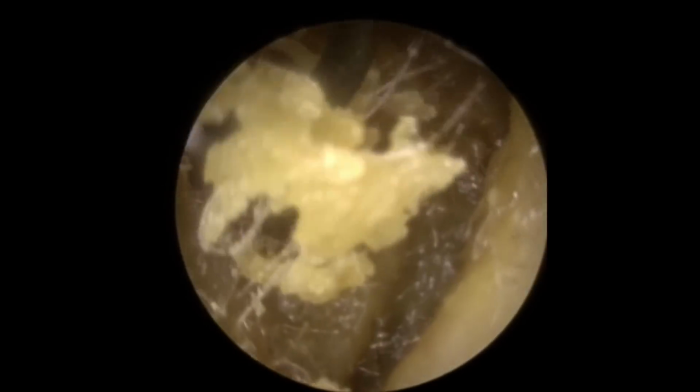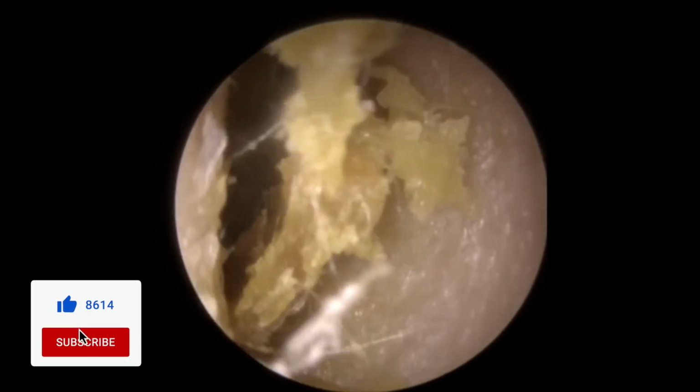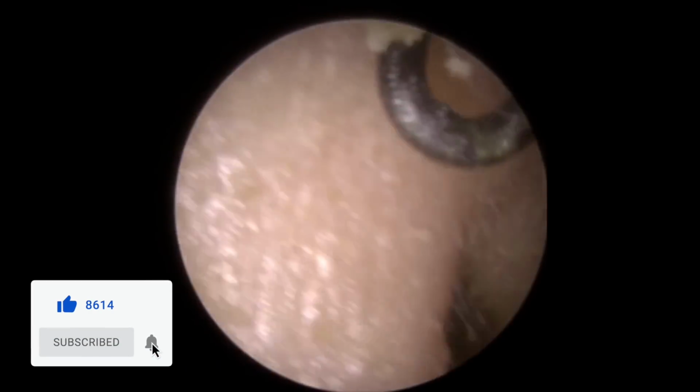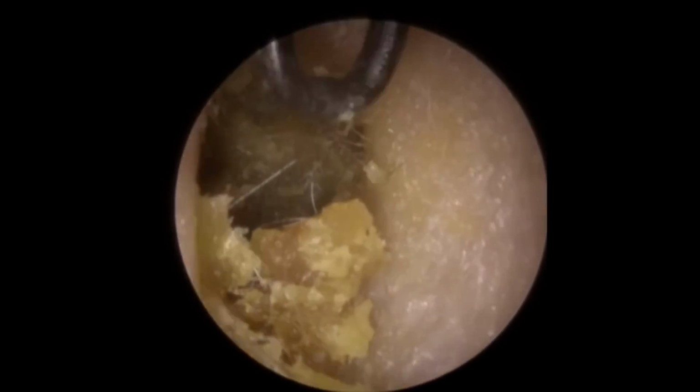So we're just using the Jobson horn now just to go over the top of this wax, just trying to push. You can see as we're trying to push into it there just how thick and firm this wax is. So as we pull, you can see the wax mainly just stretches and folds over itself. So we're just going to try and move that out of the way, just so we can get to the section behind. Now I can see there's a little gap here at the top, not quite big enough to get the Jobson horn in yet. So I'm going to keep trying to pull downwards and forwards into this wax to try and bring it out of the canal a little bit.